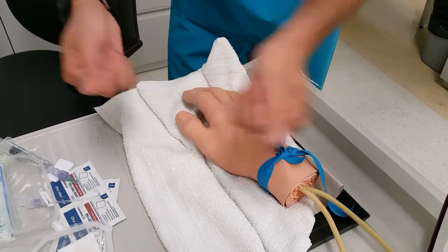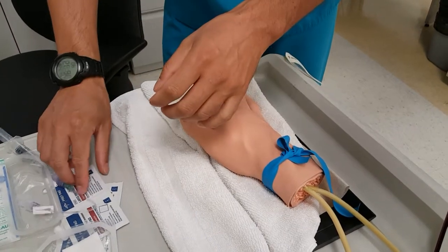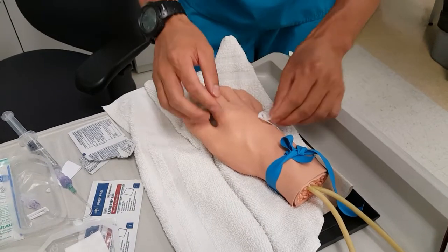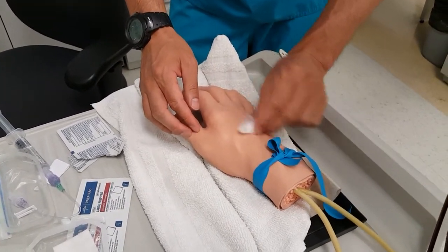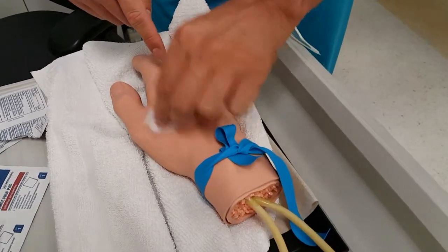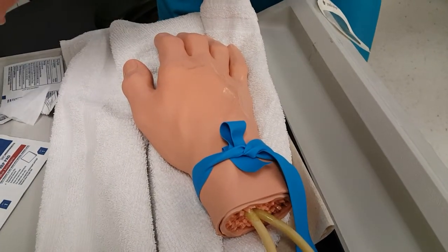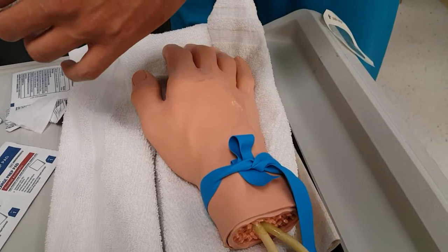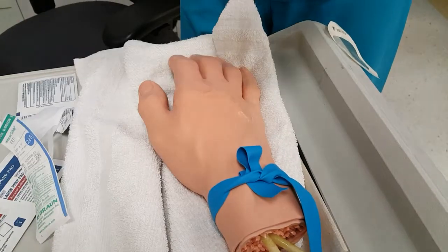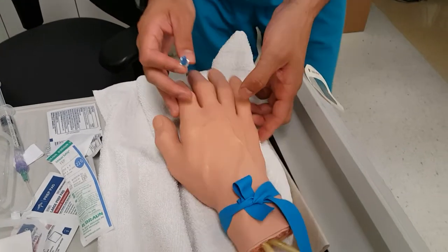I've got the tourniquet on. That's when I'd wash my hands and apply gloves, then start prepping — disinfecting the area. Even though I'm going for that specific vein, I'm going to go throughout the whole hand; I like to get that whole area prepped. Then I've got my needle ready. I've prepped my extension tubing and I've got my tape at the side, so I'm ready to go.